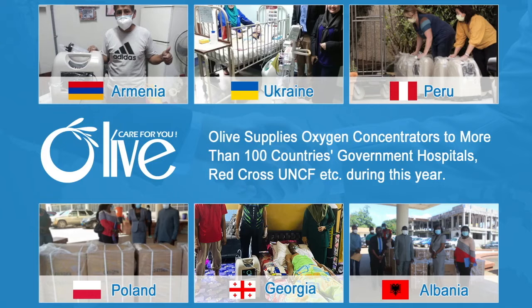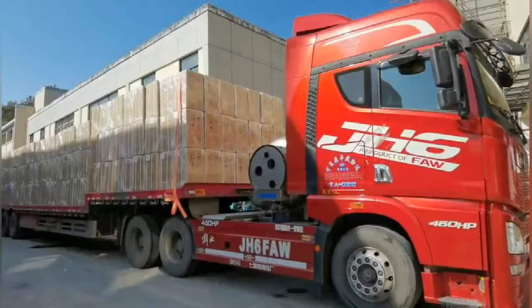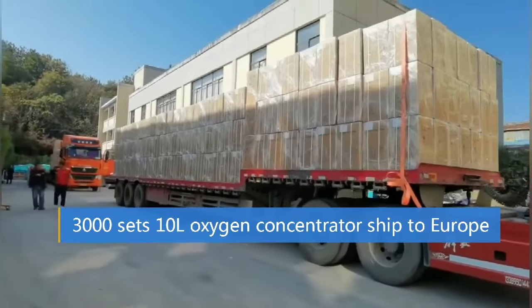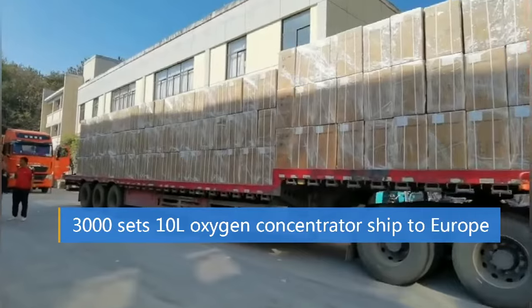Now, Olive Oxygen Concentrator has been shipped to more than 100 countries. For high quality and professional service, this year we accept many government and organization orders.